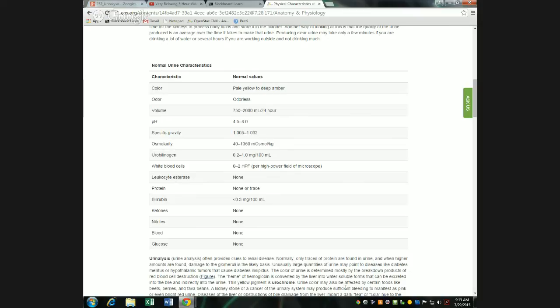I don't know how to test it, but dipsticks are usually color reactions. Usually the best way to do this kind of test. So we'll talk about that. So back to me drinking the pee.